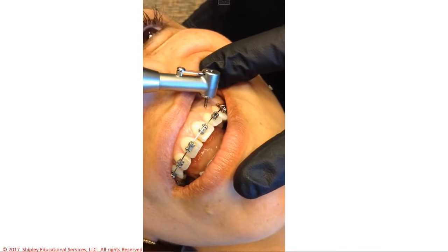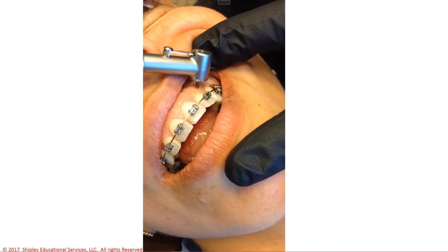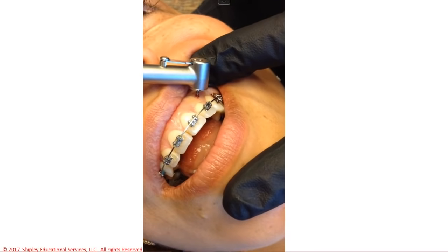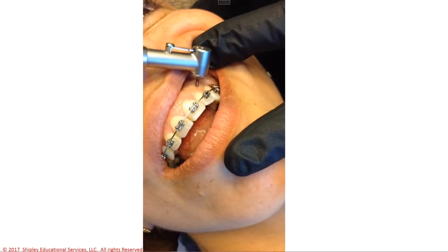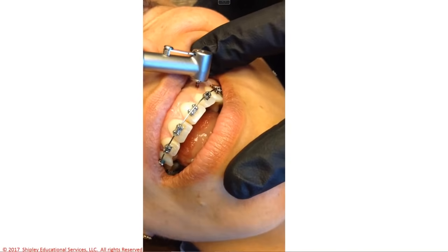Here's another one with the power driver. We're going to go in. It just takes a couple of seconds to get to 2 or 3 millimeter depth. Then we hit reverse and back it back out. That's placing one MOP with good anesthesia. You can see here that the patient's very numb. She's not feeling a thing, and this is with topical anesthesia only.